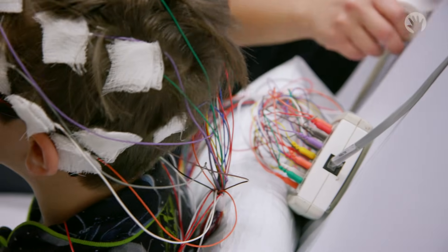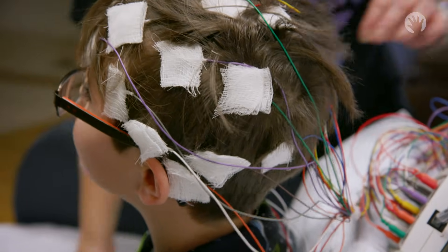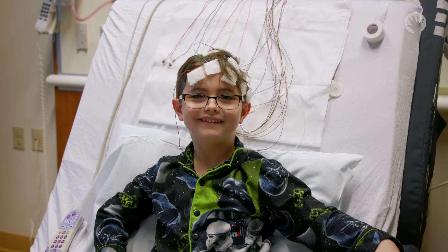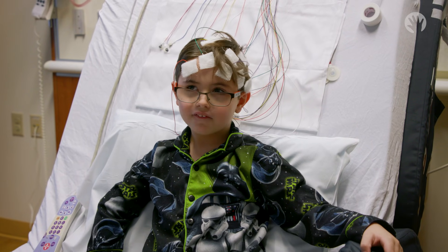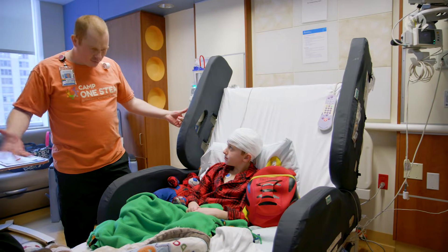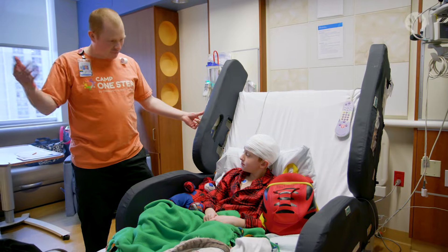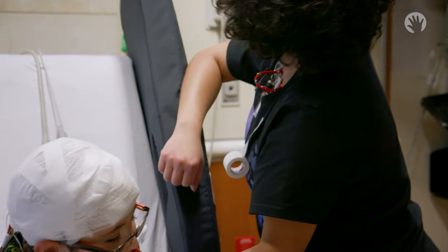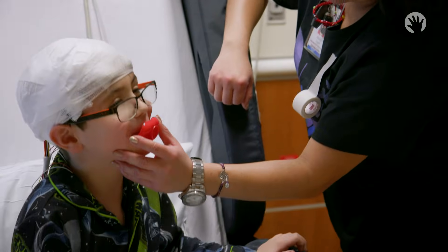When you have 23 leads going on with a bunch of wires, it's a lot for a kid to take in. One of my favorite things to do is just talk with the kids — if a kid's into comic books, I'll talk to them about comic books; if they want to talk about video games, I'll talk about video games. Asking them questions like what do you like better, waffles or pancakes — these are small things, but they end up making the child feel much more comfortable. We make sure that their test is pain-free and as smooth as possible.